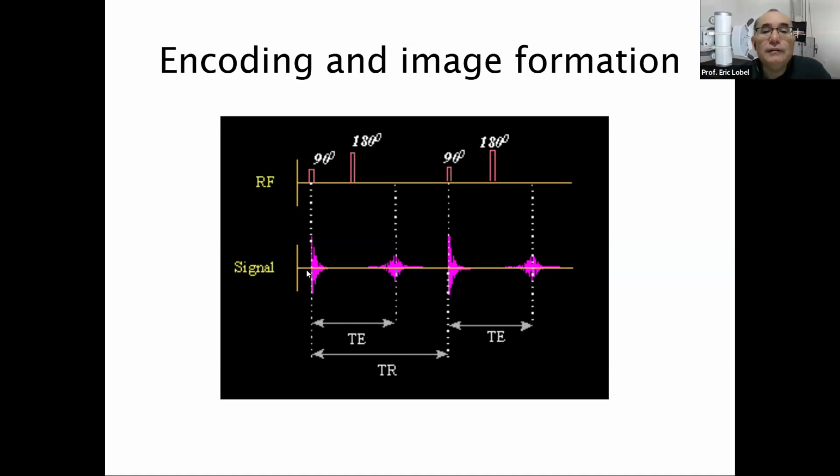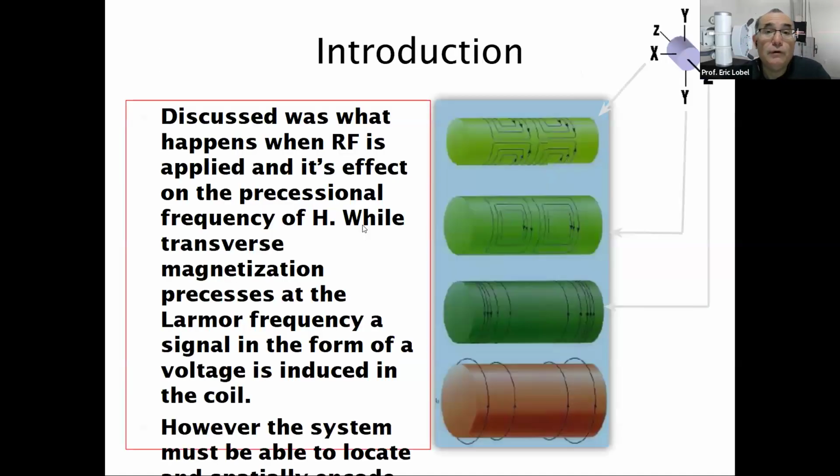We're also seeing the signal down here. It's not labeled, but this is our FID. We could see it's a very high, but half of a signal. We really generally don't collect these. There are some sequences that we do collect this data. However, generally speaking, we collect this echo here after it has been rephased by the 180-degree rephasing pulse.